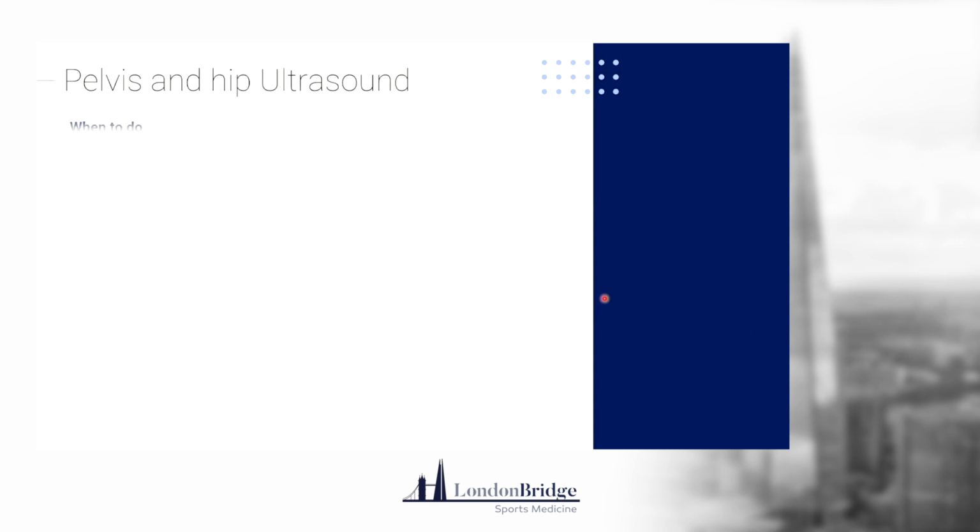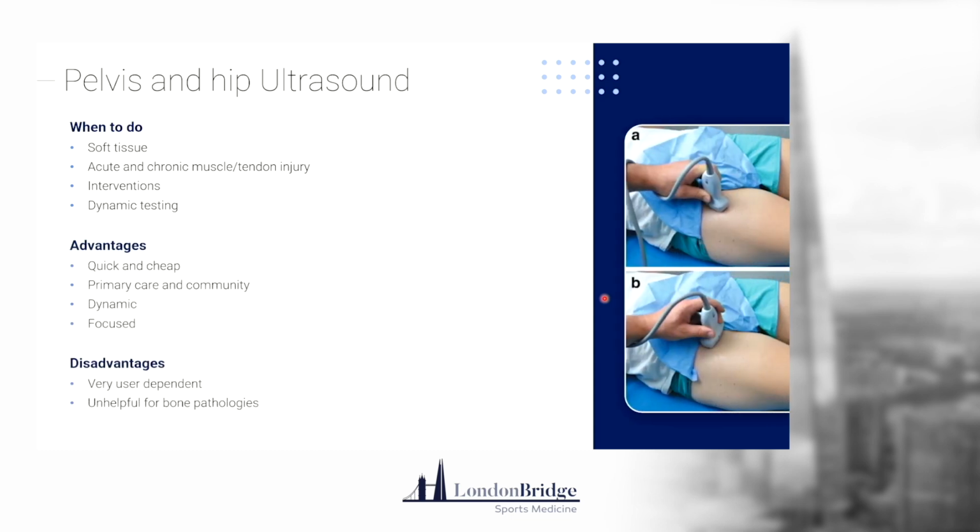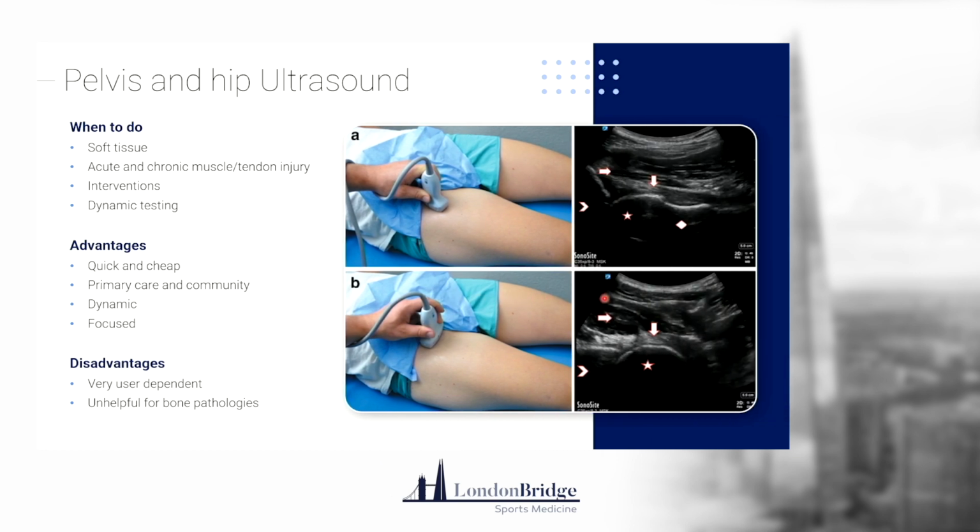So we'll just finish on ultrasound. Ultrasound, as you've probably seen for most of our talks here, is our bedrock as an SEM doctor. It's because it's an in-clinic test. You can do a lot of dynamic testing. It's quick, it's cheap. You need the expertise and the skills to be able to do it and be clear about what you're trying to achieve with the ultrasound. Hip and groin is perhaps a bit more detailed area and requires some practice.